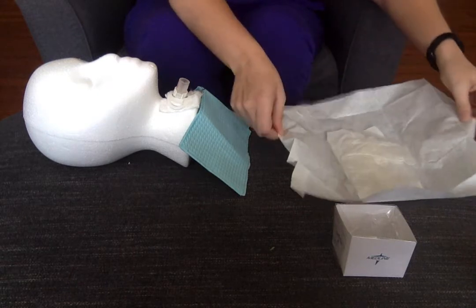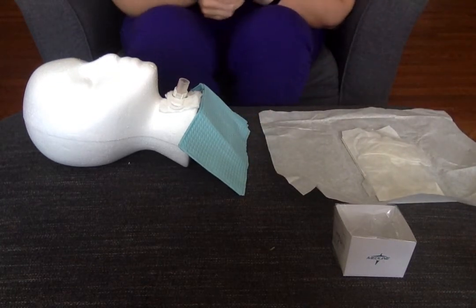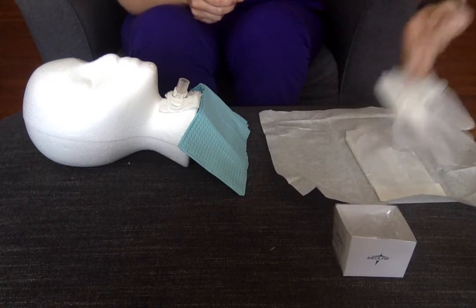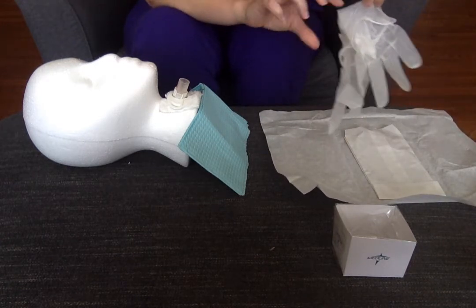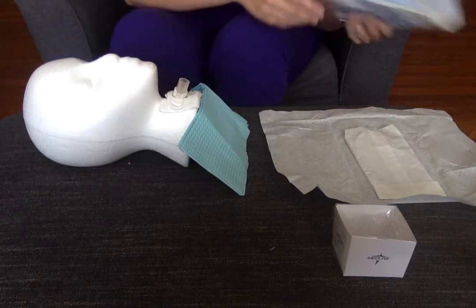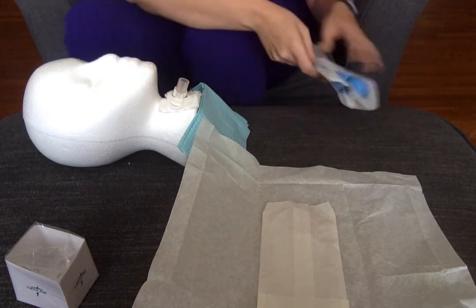I'm going to open this packaging. Remember that I am only touching that one-inch border on the outside to make sure everything inside stays sterile. This one has gloves inside so you can reach in and grab one glove. I'm going to use this other kit since my suction catheter is in here. Remember, if you sterile glove, it has to be off of your sterile field — so if I'm opening this package, it's got to be over here, away from the field.